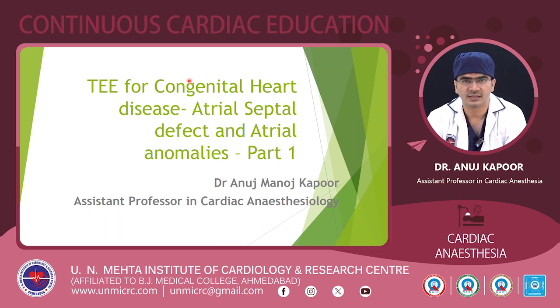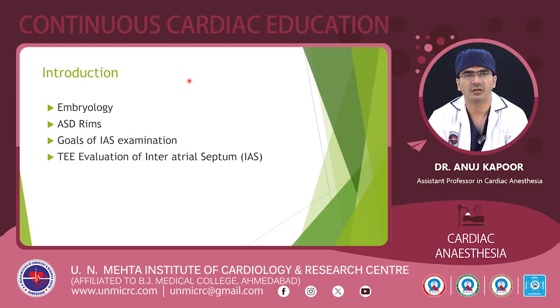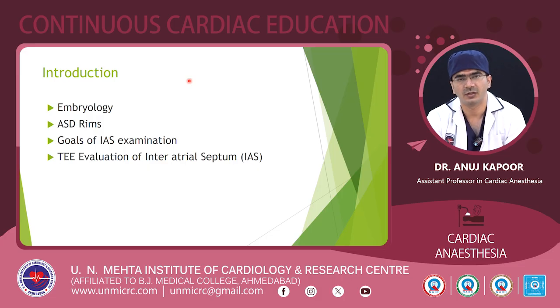Today, we will be discussing the topic of transesophageal echocardiography for congenital heart disease, for atrial septal defects and atrial anomalies, part 1. A brief summary of what we will be discussing today: first of all, a short review of the embryology for understanding the basic development of the atrial septum.